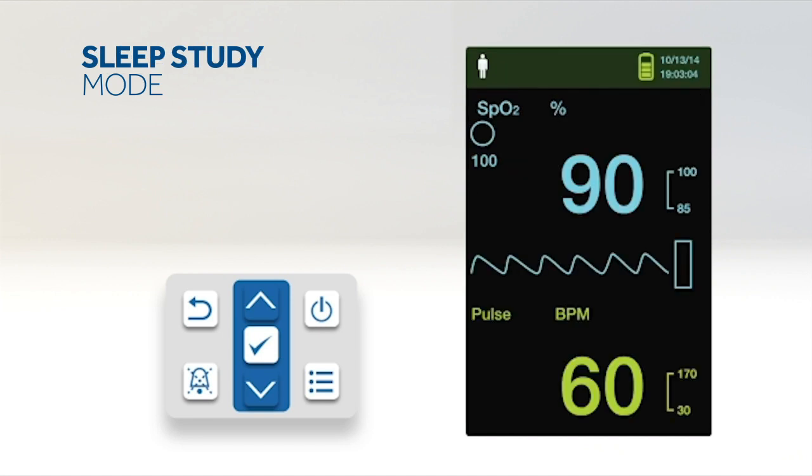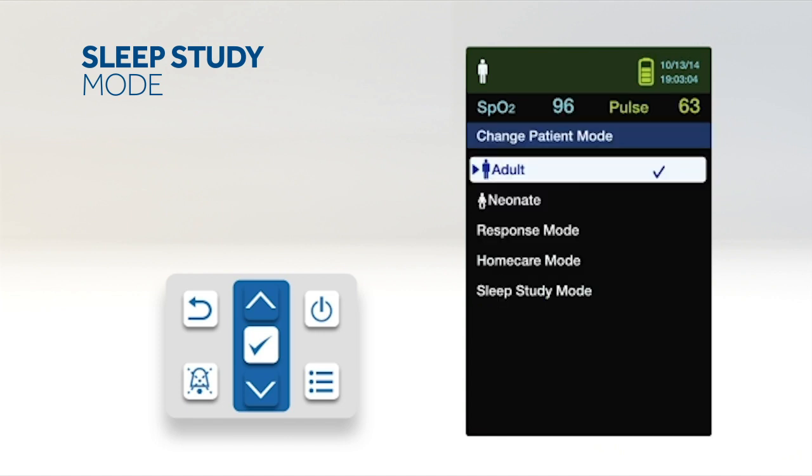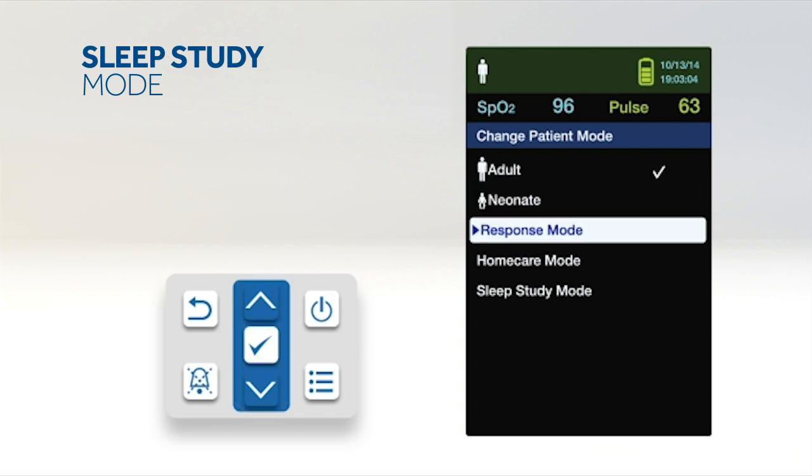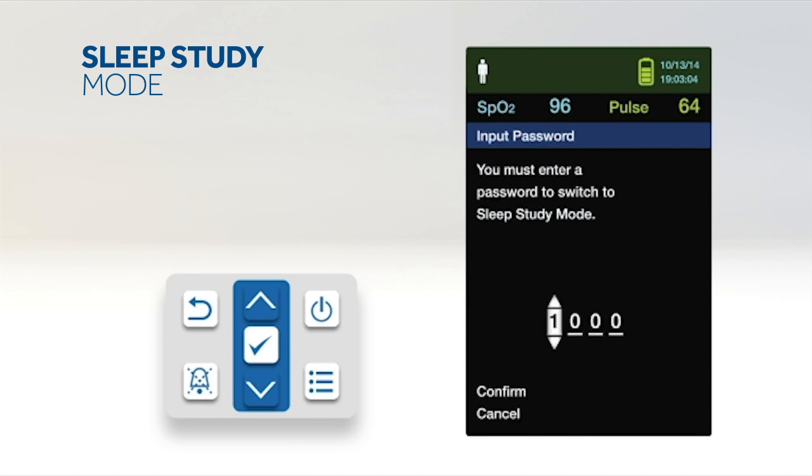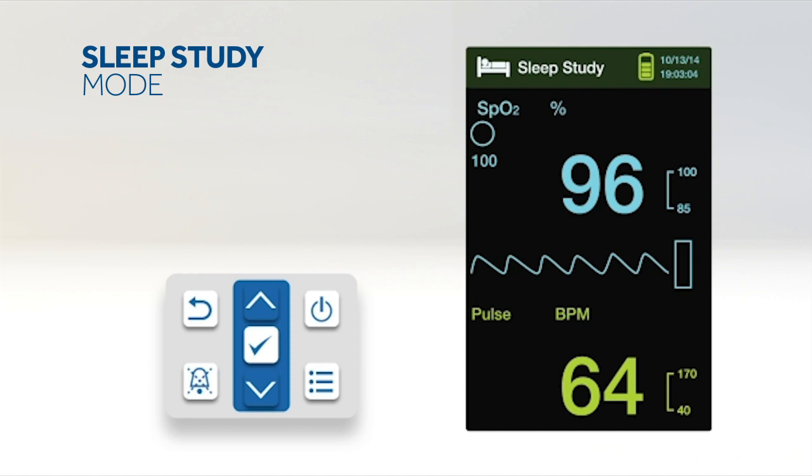When a sleep study will be performed on a patient, set the monitoring system to sleep study mode — the alarms will be silenced and the screen will be dimmed. To set sleep study mode, access the change patient mode menu, press up or down to highlight sleep study mode, then press OK to select. Enter the four-digit passcode and select confirm to enter sleep study mode. If buttons have not been pressed for three minutes, the screen will dim; press any button to brighten it. To return to standard mode, access the patient mode menu and enter the passcode for standard mode.